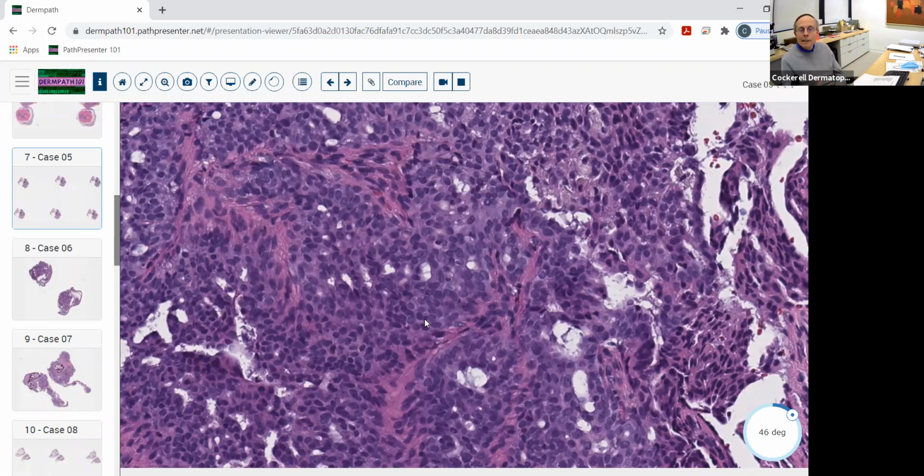Like I always say, it's like the three bears. It can't be too hot, too cold. It has to be just right. So you can't overcall this. You can't scare the heck out of the patient, saying, oh, this could be evolving into malignancy and all that. You just have to know the criteria and apply it. And this is a totally benign lesion. So it's not a cancer.